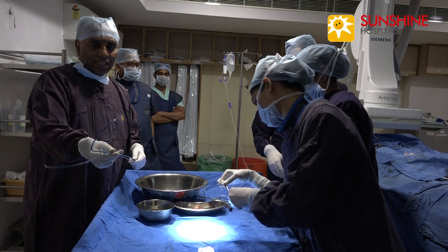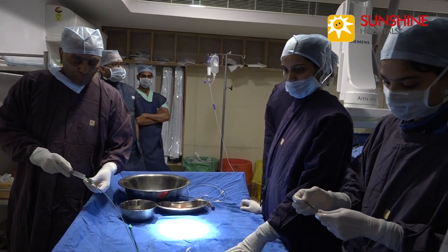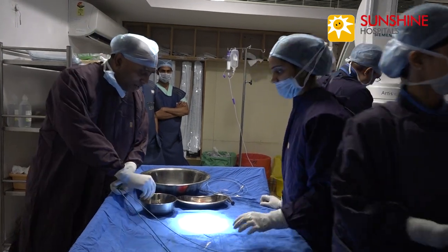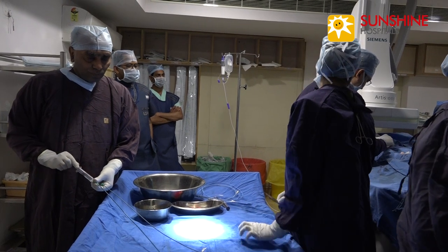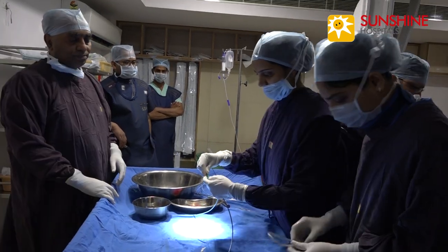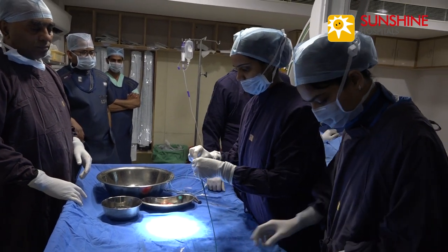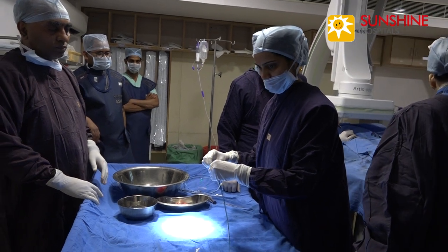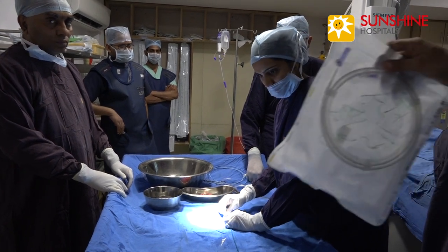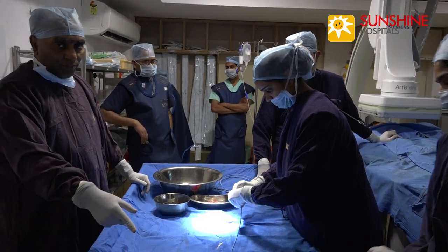Now we are showing how to prepare a ductus delivery sheath and loader. Now we are seeing a PDA device, dilator and a sheath. Both should be flushed with heparinized saline, and the dilator is inserted into the PDA sheath. Now we have taken an 8 French ductus sheath. Now we are loading the PDA dilator into the sheath.